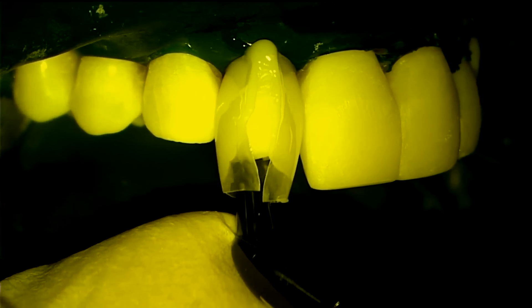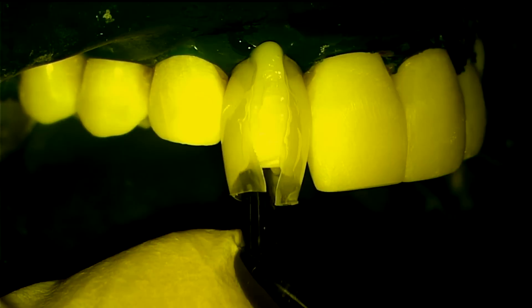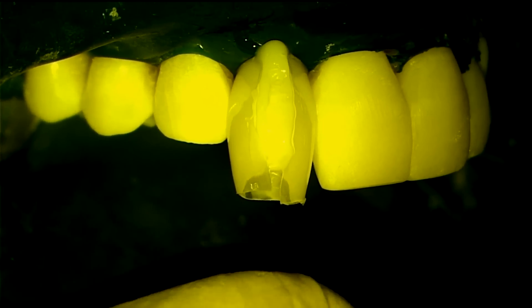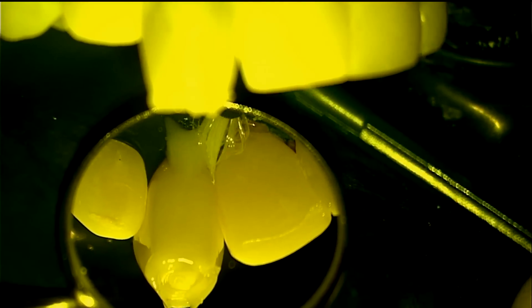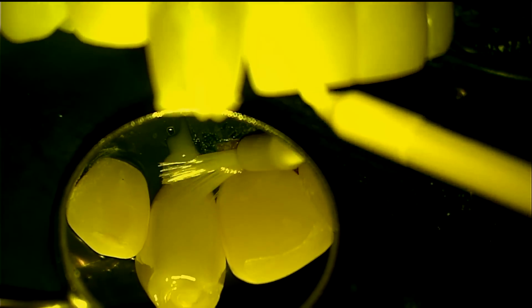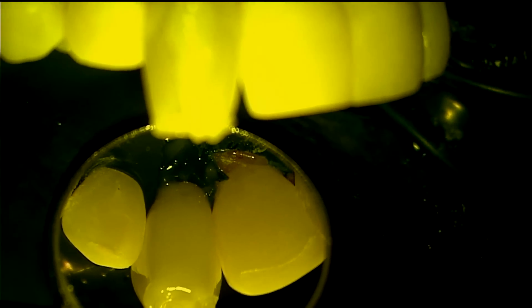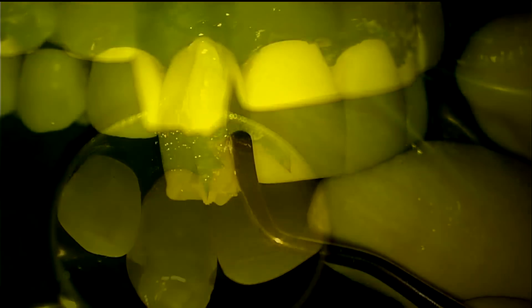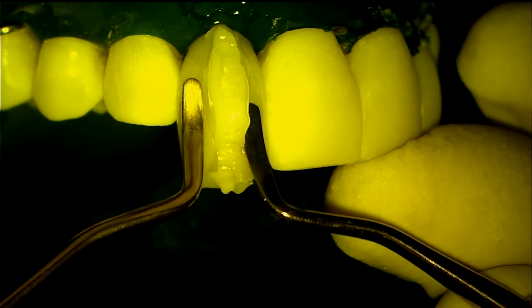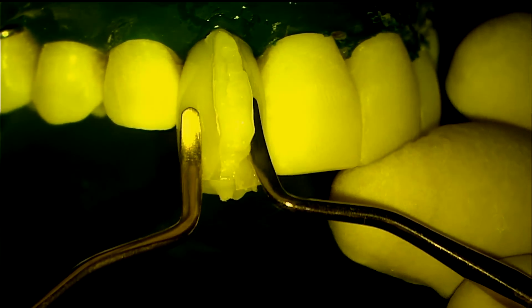Two to three millimeters of excess composite on the incisal is a safe volume to avoid having a void. Use two BioClear paddle instruments together to readapt the matrices and to push excess composite out toward the facial through the vent.